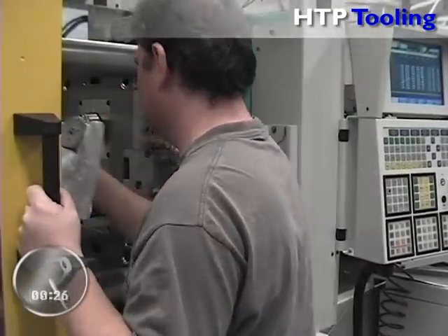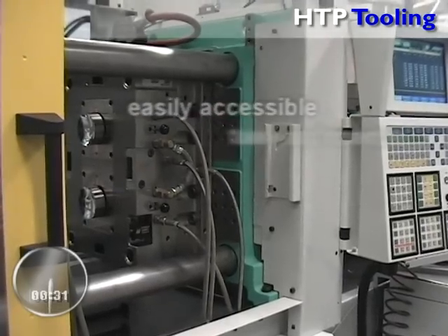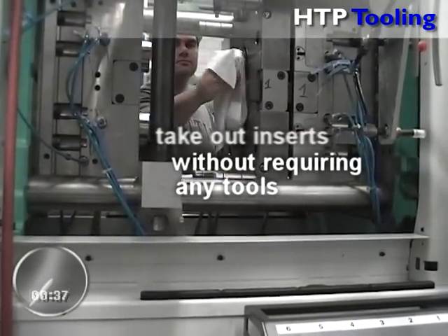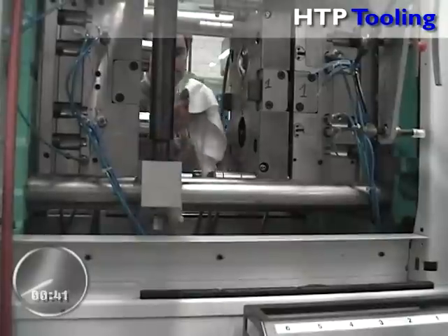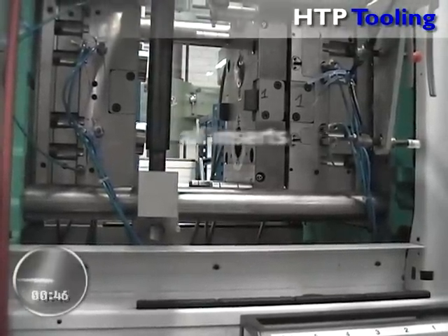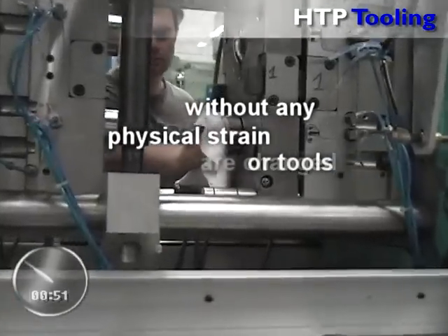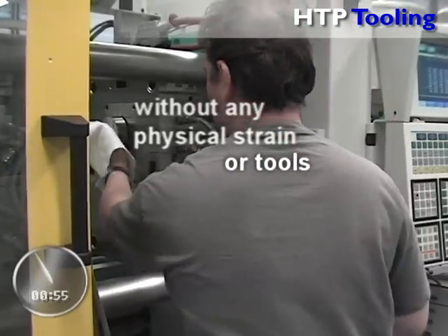The patented quick change system is easily accessible and is designed in such a way that the operator can take out the inserts without requiring any special accessories or tools. As you can see, all four inserts — front and back — are changed by the operator without any physical strain or any additional tools, other than cleanroom cloth to protect the optical surface of the insert.